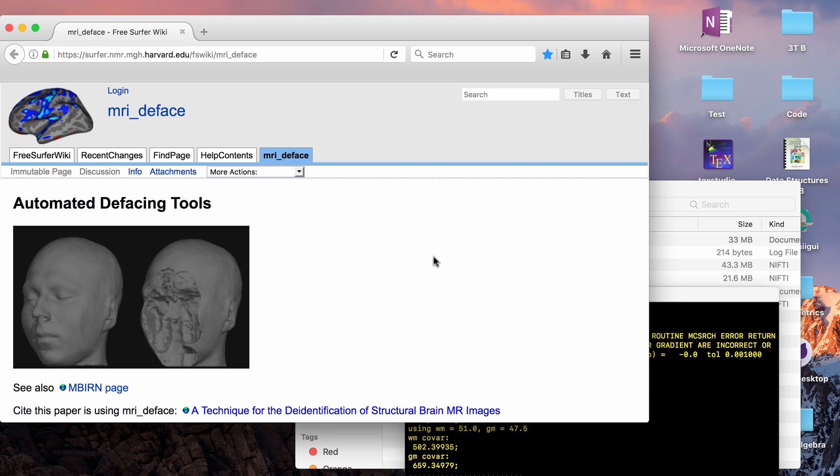Hey guys, in this video I'm going to go over how to anonymize data. I'm going to talk first about de-identification of MRI data and then I'll go over how to deface data afterwards.